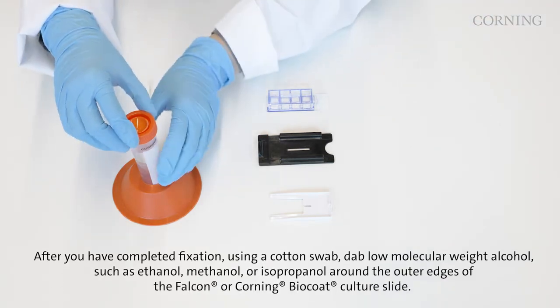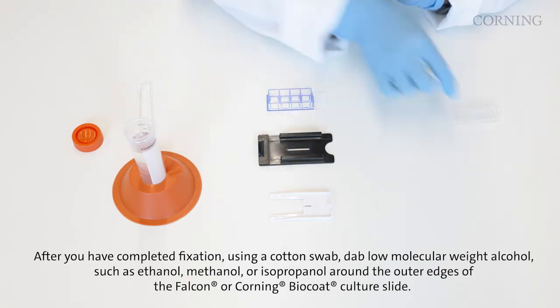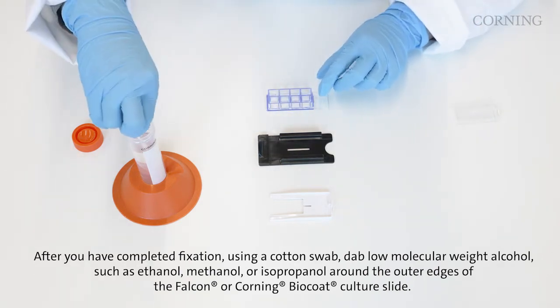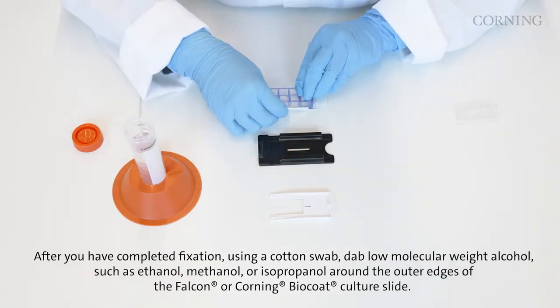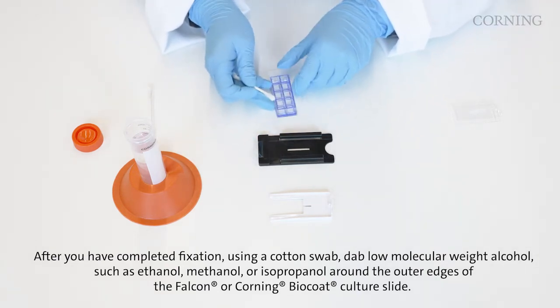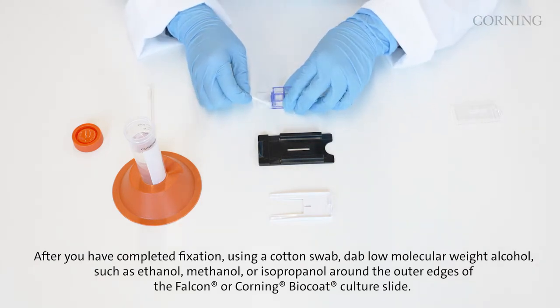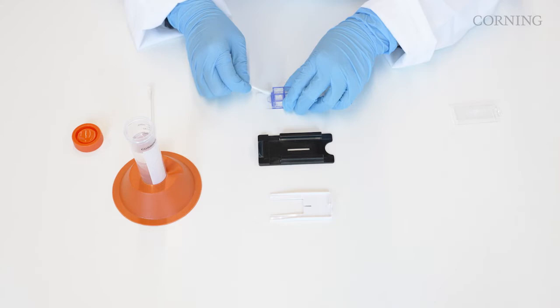After you have completed fixation, using a cotton swab, dab low molecular weight alcohol such as ethanol, methanol, or isopropanol around the outer edges of the Falcon or Corning BioCoat culture slides. This will loosen the adhesive.